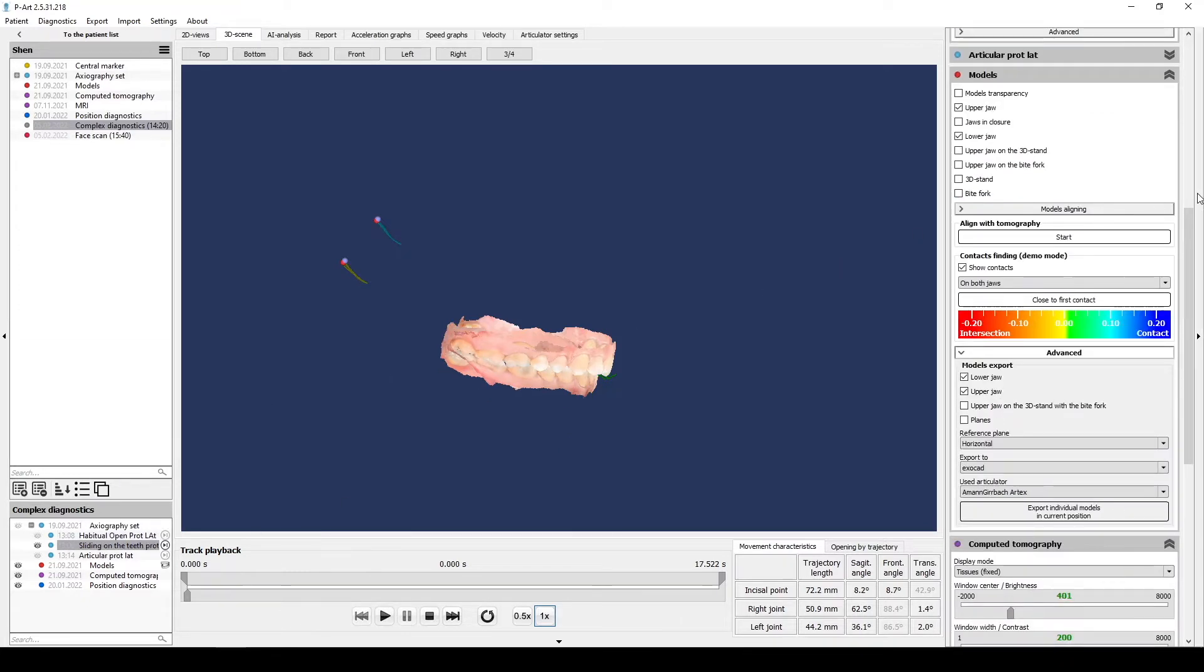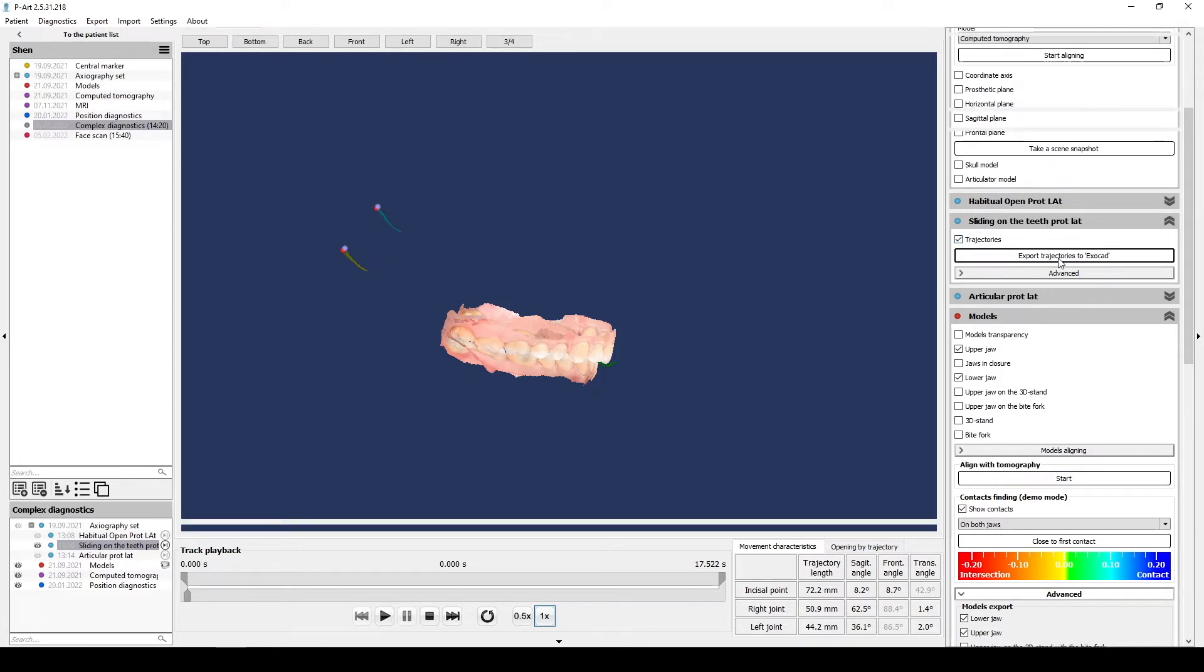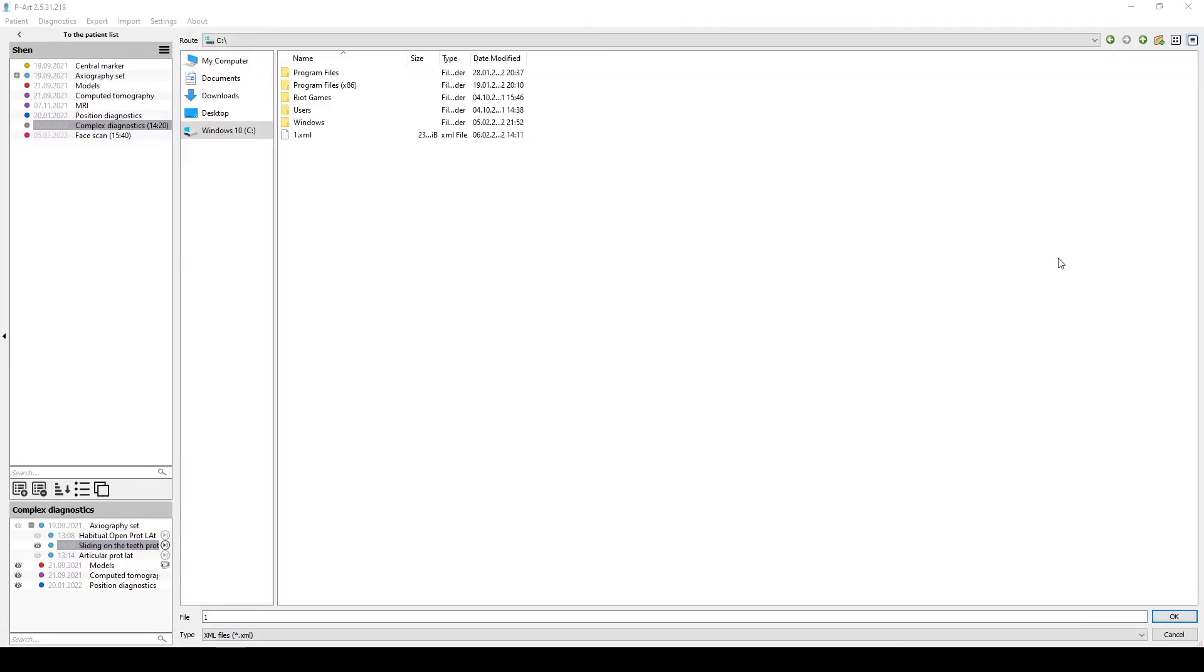Select a needed trajectory and click Export trajectory to ExoCAD. Select the location where you want to save the file and save it in XML format.